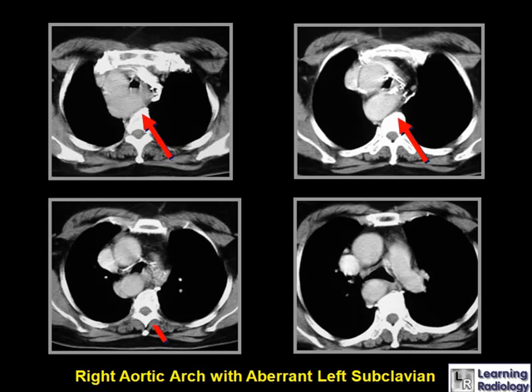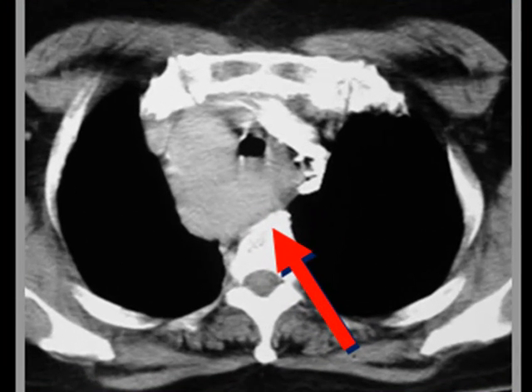This is a CT example of a right aortic arch with an aberrant left subclavian artery. You can see that the arch is on the right side and that there is a vessel that insinuates itself behind the trachea and the esophagus — the aberrant left subclavian artery passing toward the left side of the body.